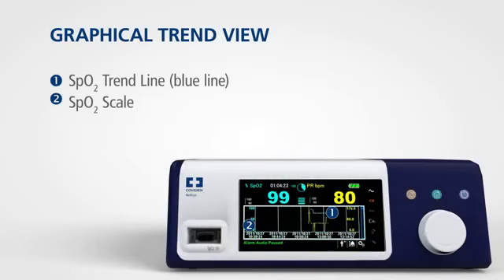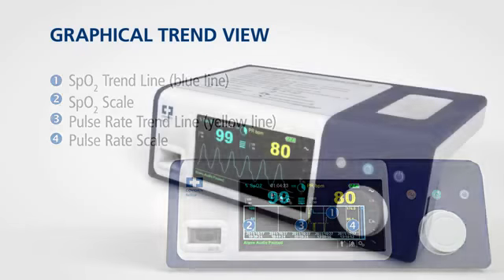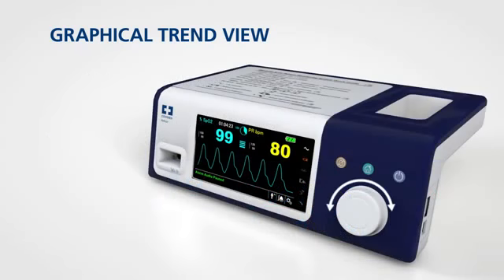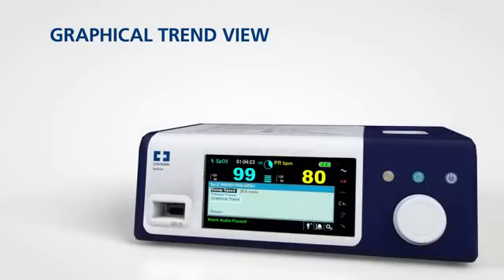The monitoring system presents trend information in a single graph for all monitored parameters when you enable this option. To access the graphical trend view, rotate the jog dial to highlight the waveform or trend display area and press. Select Graphical Trend and press again.